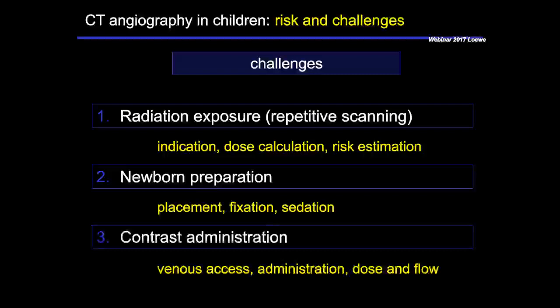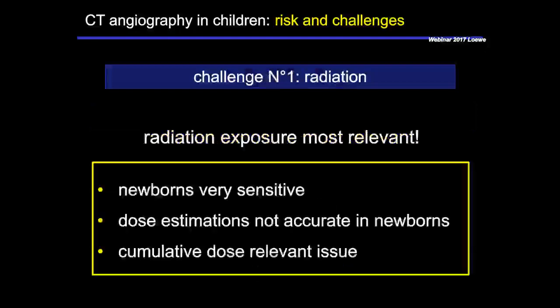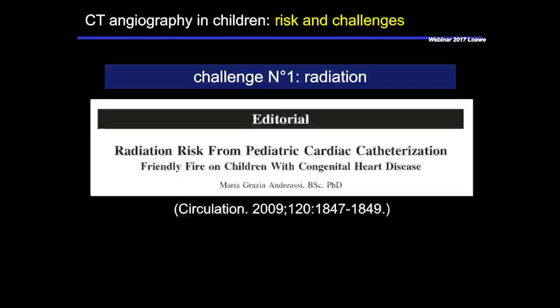This is the number one challenge and the number one fear in clinical reality, because newborns are very sensitive and very small, and you don't know how old they will become, so how much dose they will get during their lifetime. The cumulative dose is a relevant issue, and the practical problem is that the current dose estimations are not really accurate for newborns. So there is a good reason for the radiation fear.